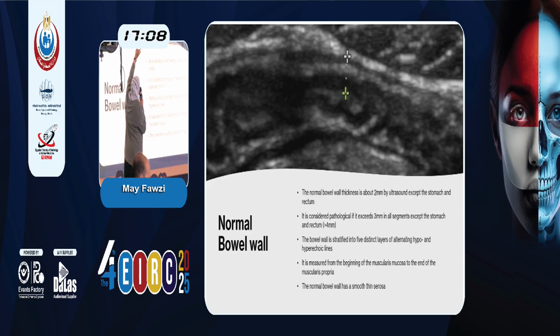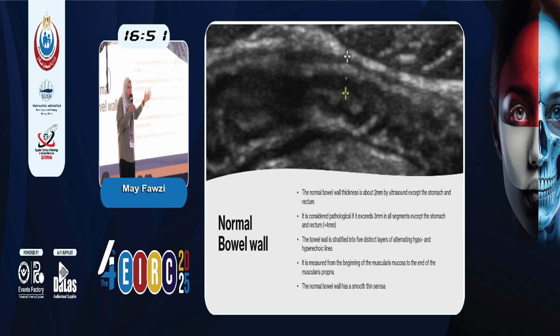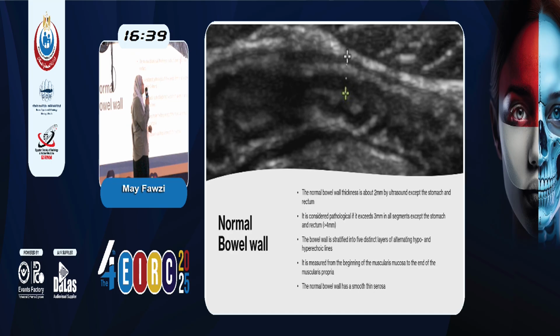And then the black part is the mucosa. This is part muscle, part fluid, part cell. And then the white in the middle is the submucosa. It's white because it has less water. It contains vessels and collagen and cells. And then there's the muscularis propria, which is a muscle layer. This is black, more water, as you all know, you're radiologists. And lastly, the last white line is the serosa.